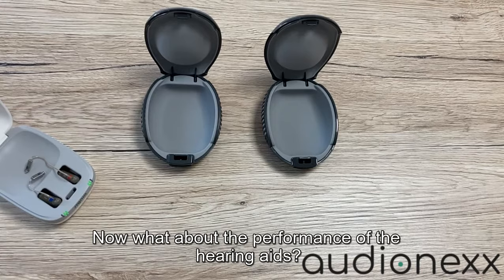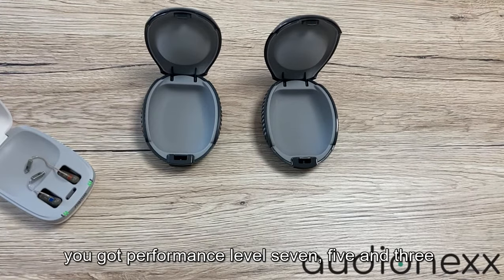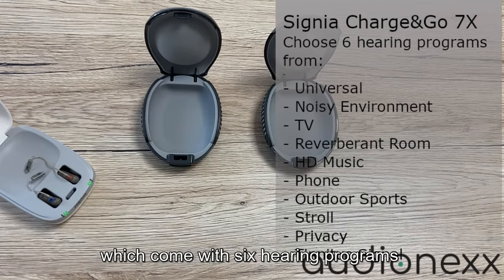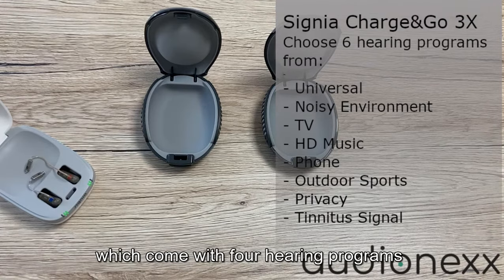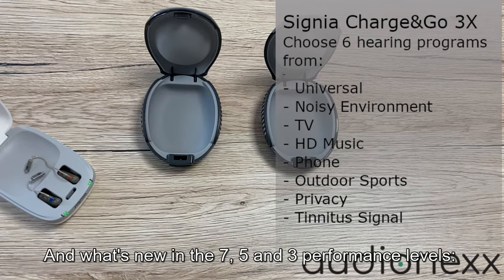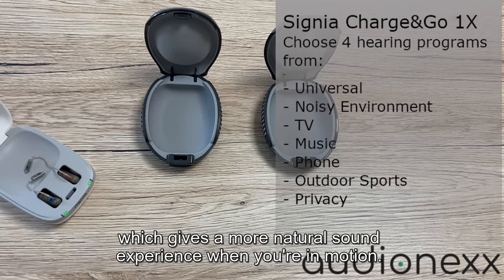Now what about the performance of the hearing aids? The Signia Pure Charging Go X comes in five performance levels. You get performance levels seven, five, and three, which come with six hearing programs, and you get two and one, which come with four hearing programs. What's new in the seven, five, and three performance levels is the acoustic motion sensor, which gives a more natural sound experience when you're in motion.